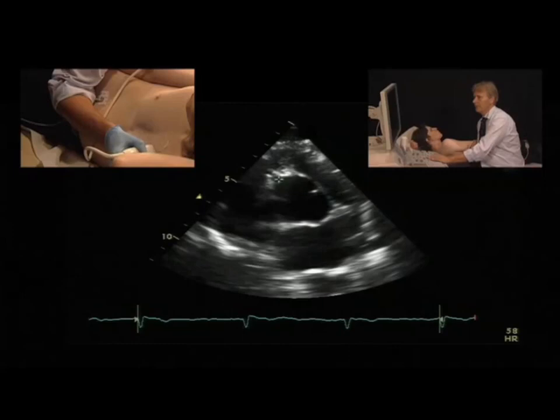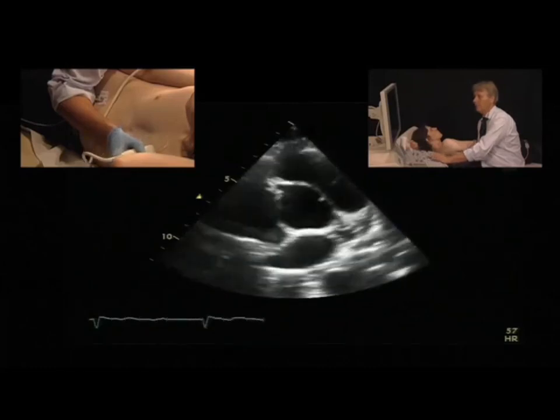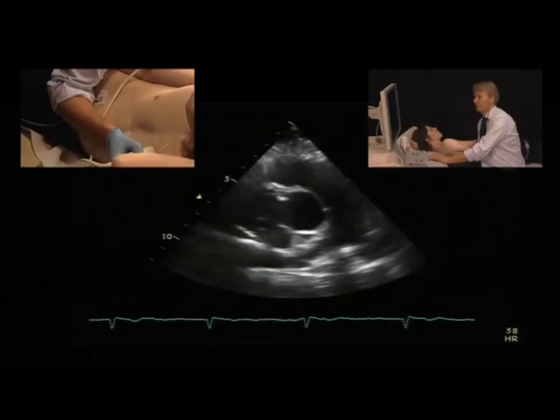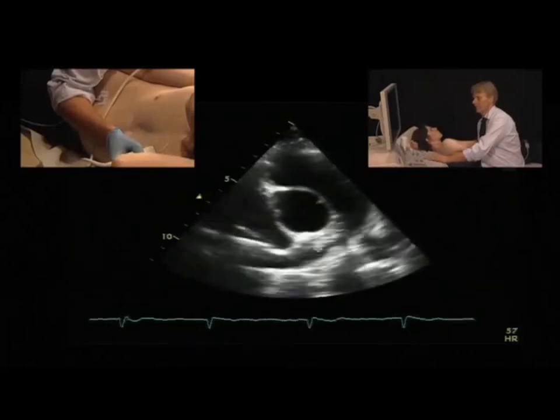For example, here it is possible to even see the origin of the right coronary artery. The left coronary artery is more difficult to visualize in a short axis view. It would be somewhere down here.